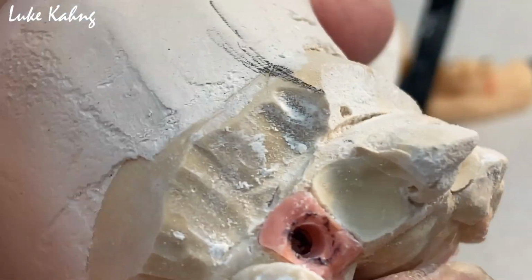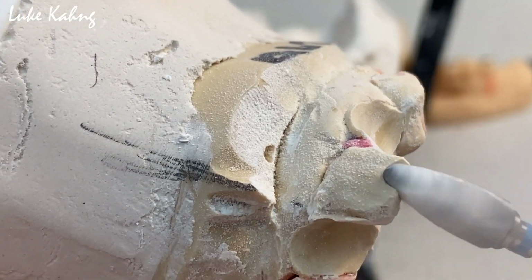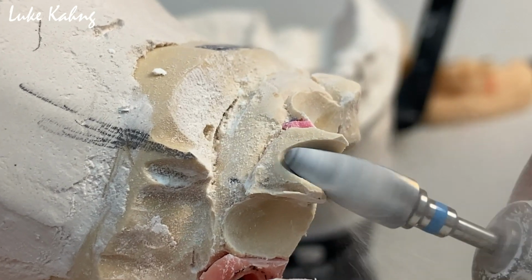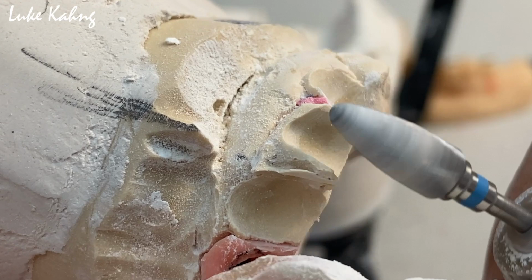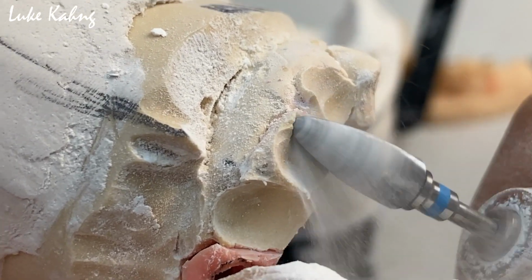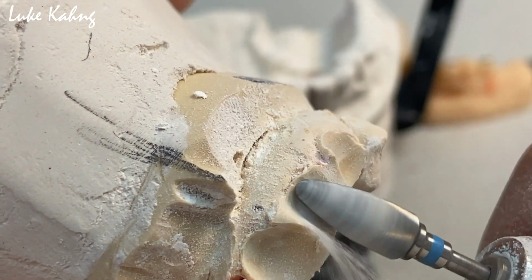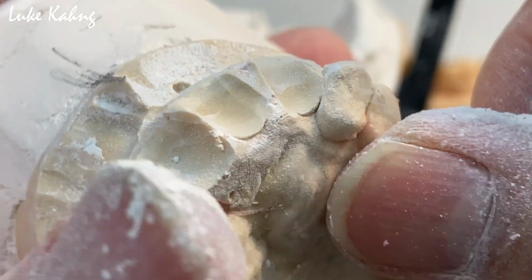Number two, make the temporary, implant temporary, okay? So if you pull out the tooth, you can imitate it. I can check out the tooth. The same as the immediate denture concept. Right here, all the way, and open up, put full shape, just make sure. Full shape.